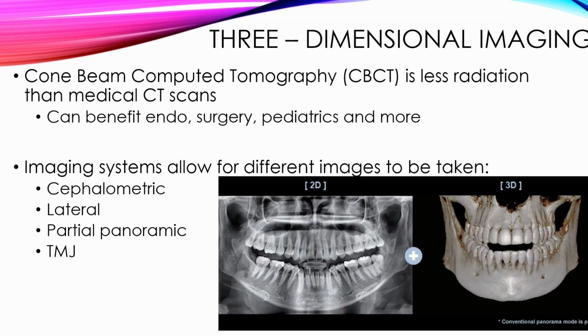Let's talk about the cone beam computed tomography, or the CBCT. This technology has advanced in the last decade. It's allowing both general and specialty practices to utilize it for many different reasons. These scans offer clear and detailed images in both two-dimensional and three-dimensional views.